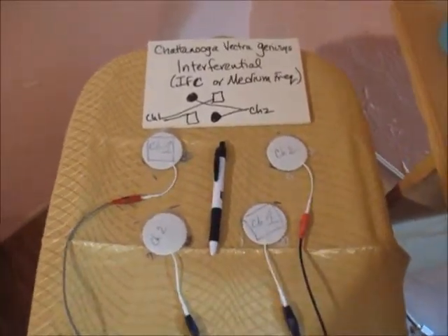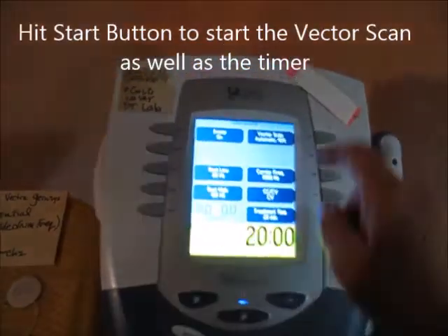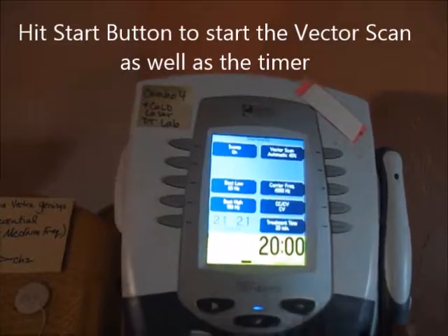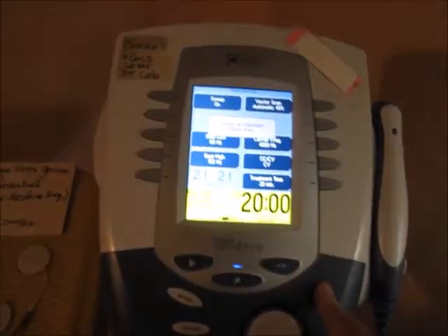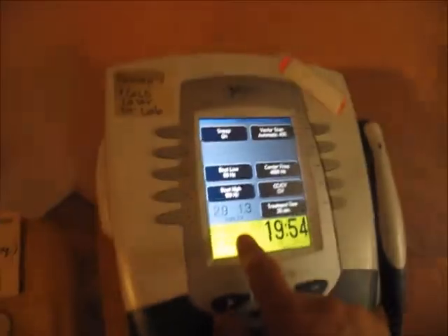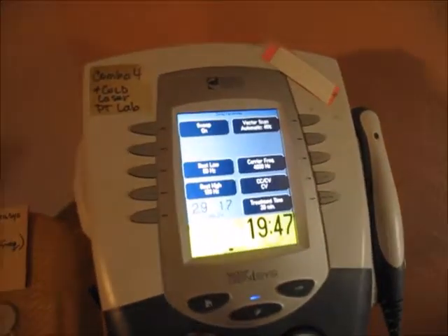Don't worry about the reds and blacks. Turn up the intensity to patient tolerance, and when you hit the actual start button, that's when the vector scan will begin. Make sure you set your intensity to where you want it before hitting start, because if you try to change intensity midstream it gets confusing — the numbers are fluctuating and you won't know how you're affecting the output.